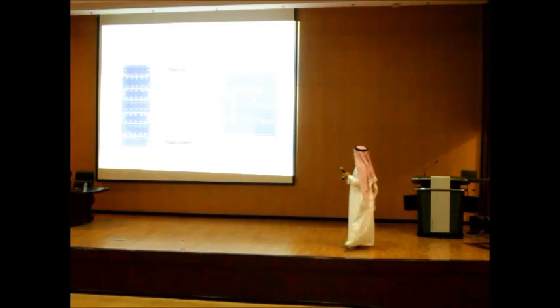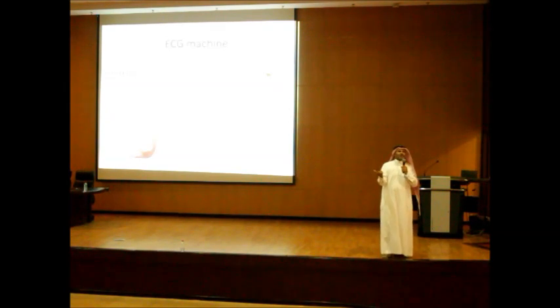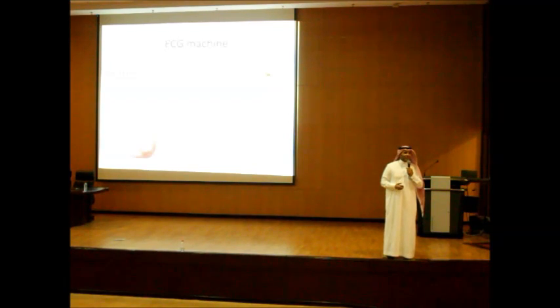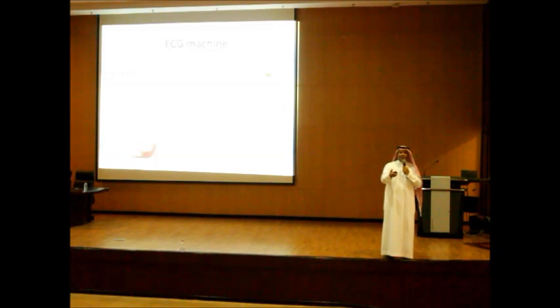So now, why do we do ECG? Why do we do ECG? Okay. What else? Okay. What abnormality? Hypertrophy. What else? Arrhythmias. What else? Ischemia. What else?